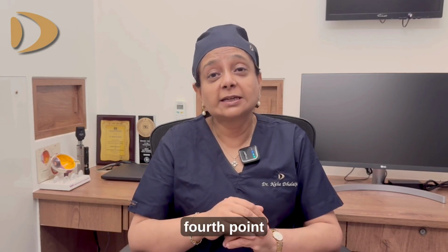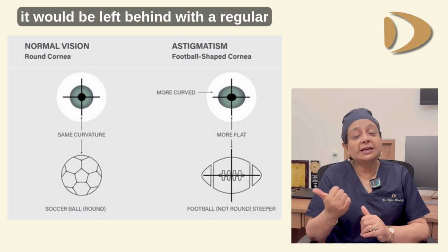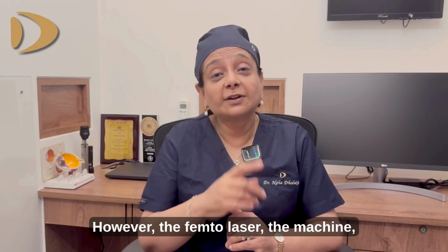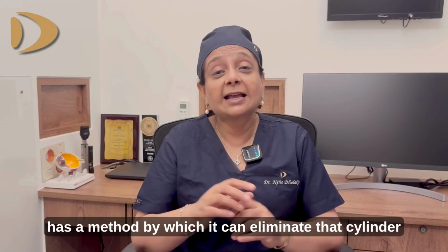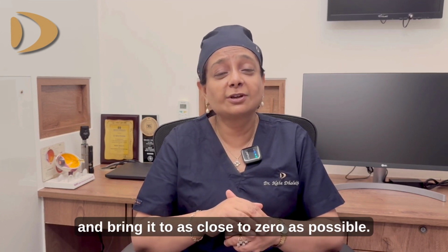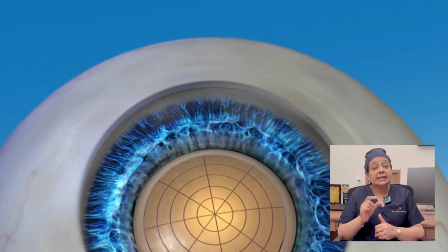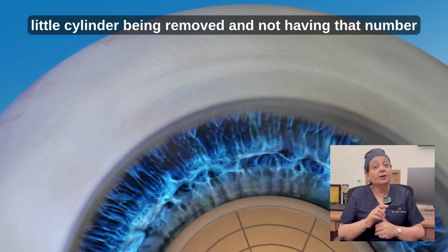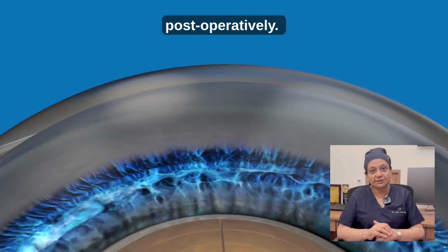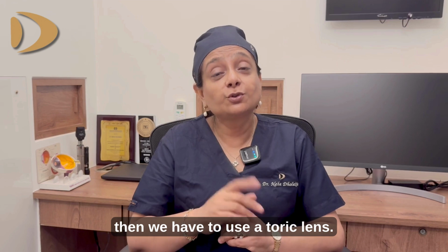The fourth point is the cylindrical number. If you have a small cylindrical number, it would be left behind with a regular phacoemulsification surgery. However, the femto laser machine has a method by which it can eliminate that cylinder and bring it to as close to zero as possible. I feel this is one of the most important points because that little cylinder being removed and not having that number gives much more clarity in the vision postoperatively. And if you have a larger cylindrical number, then we have to use a toric lens.